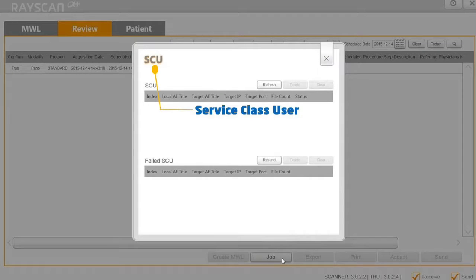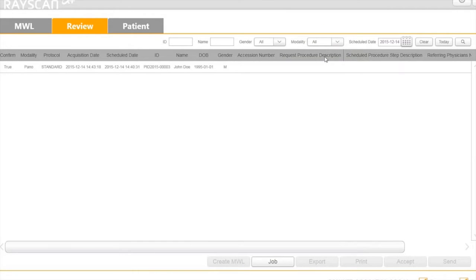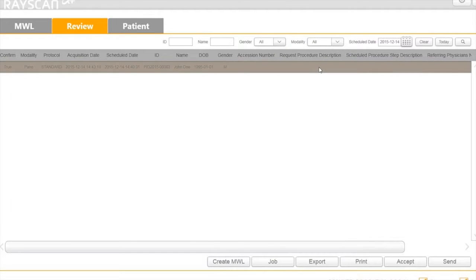SCU refers to Service Class User. You can check the transferring status if you use a PACS system.